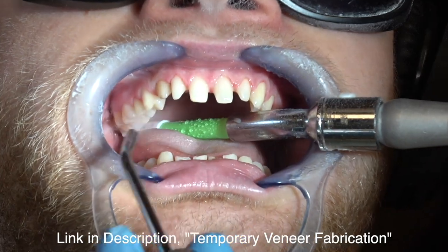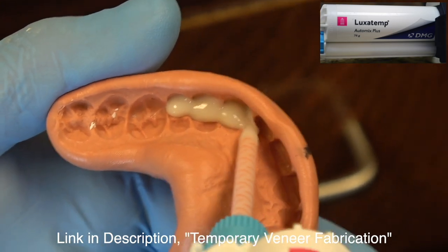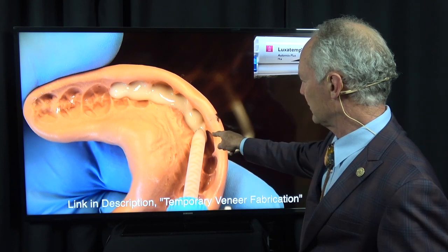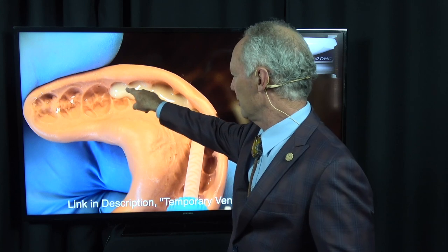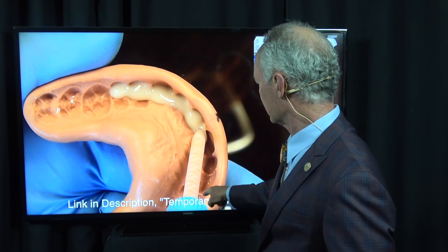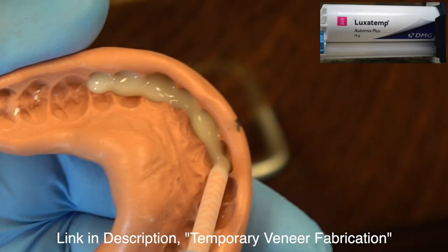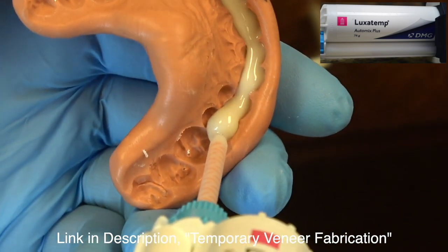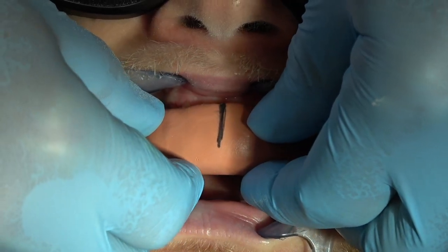So you wet the prepared teeth thoroughly and leave the water on the teeth, then squirt the bisacrylate into the matrix. Be sure you keep the tip of the bisacrylate gun on the incisal surface of the matrix so that no air bubbles develop. You don't want to just squirt it in there. You want to keep the tip rubbing against the bottom of the matrix. See, I'm rubbing it in there. Then wet the teeth, put it in place.